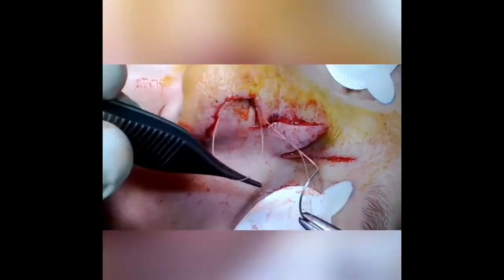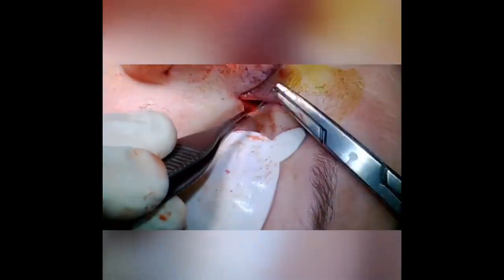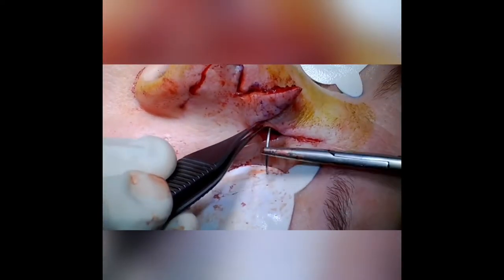Several deep sutures are placed to secure the position of the first lobe, which will allow us to evert the skin edges with no tension when placing the second layer.